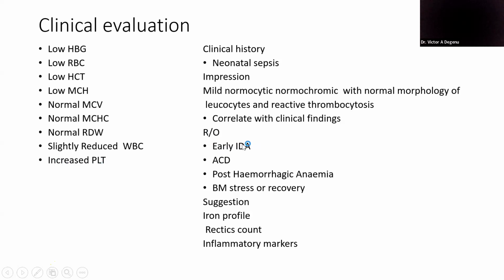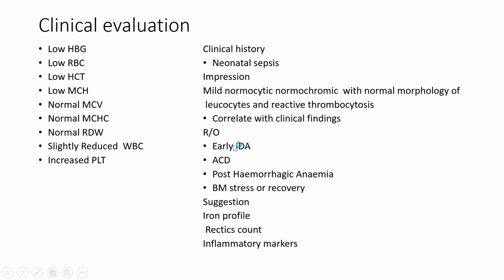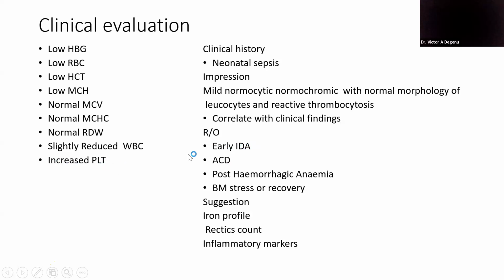Platelet is increased. I hope you know that. In iron deficiency, yes, some of them is increased. So based on that, because we are suspecting iron deficiency, that might be why platelet has increased. Okay. So that is it. Any more question?